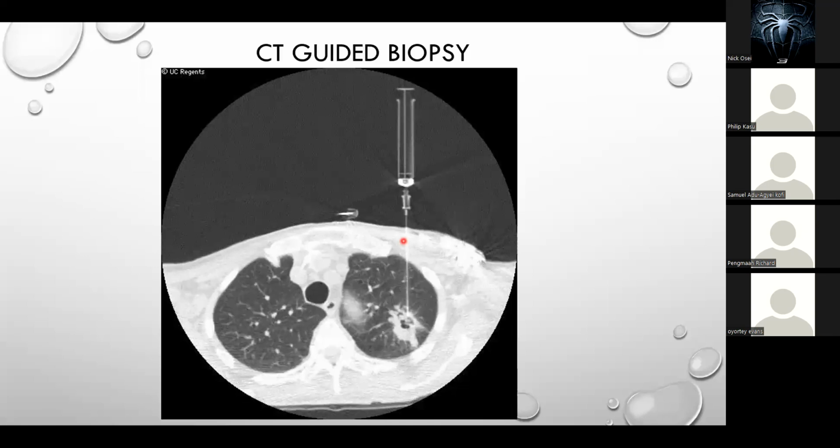Yes, then the other application we have for CT scans is CT guided biopsy. And I think we talked about the same thing in the ultrasound. Remind me, we have to go back to the ultrasound. Let me tell you of some additions at least. So over here, there is a tumor in this person's lungs, okay? So they want to do a biopsy of it.